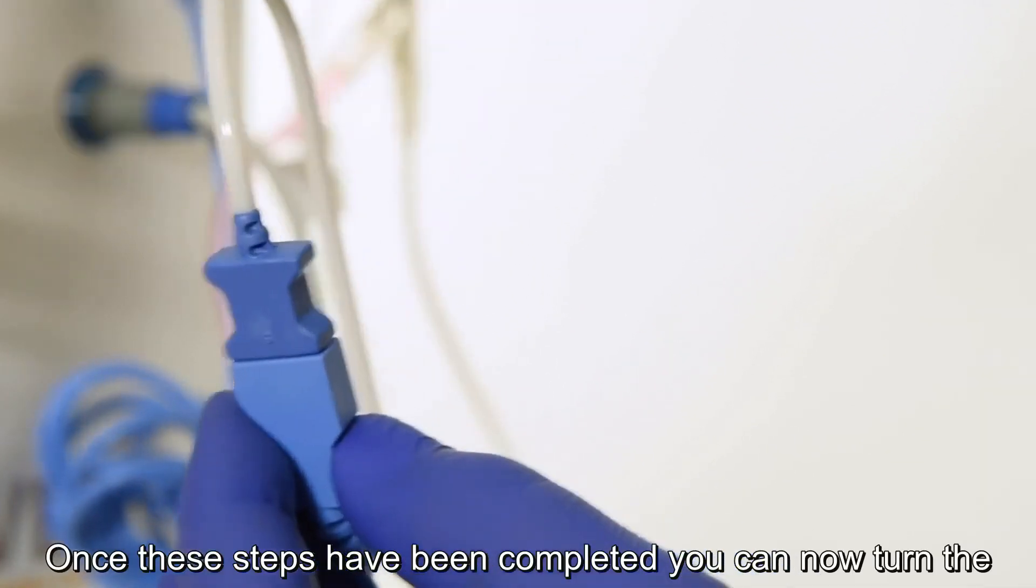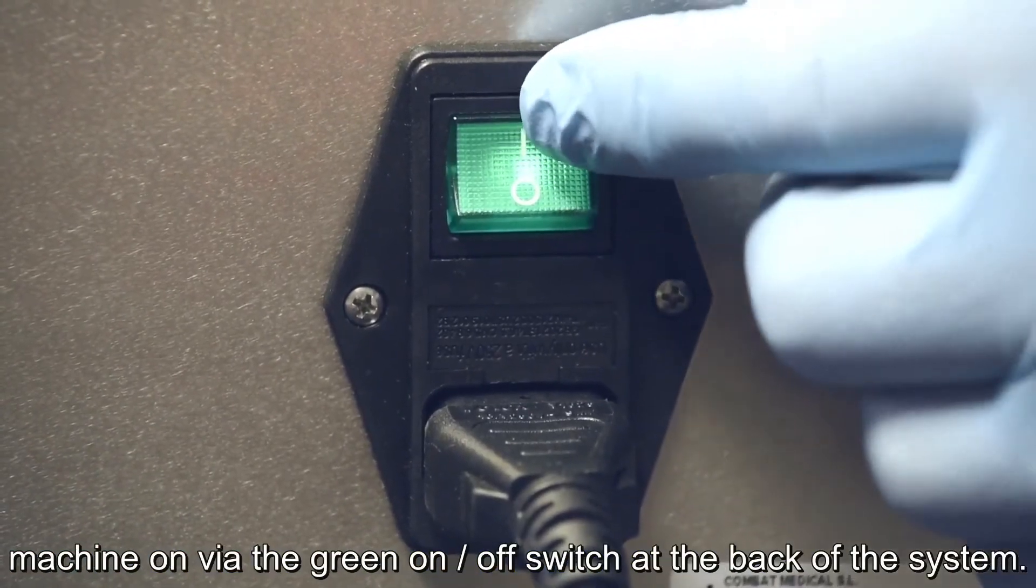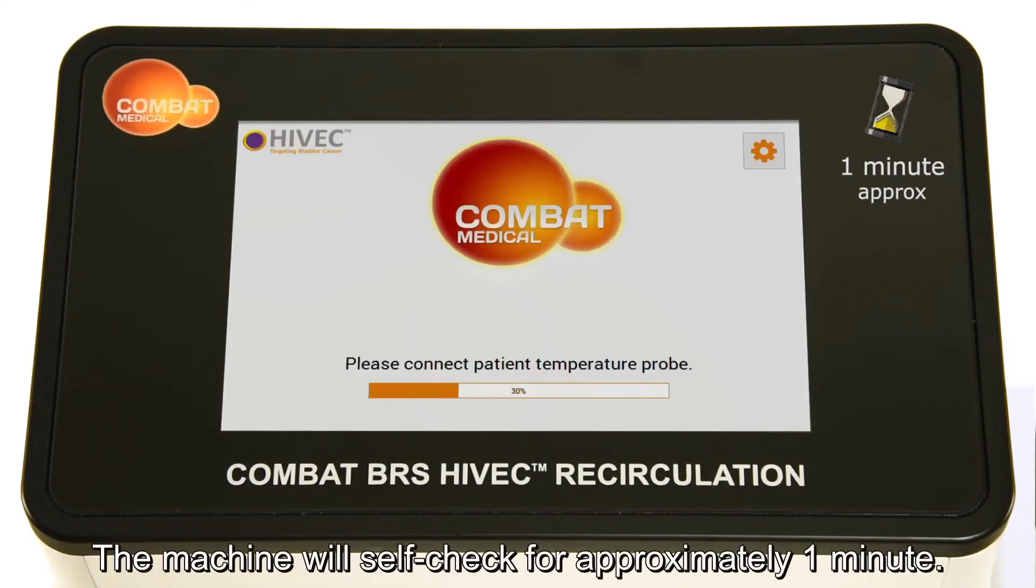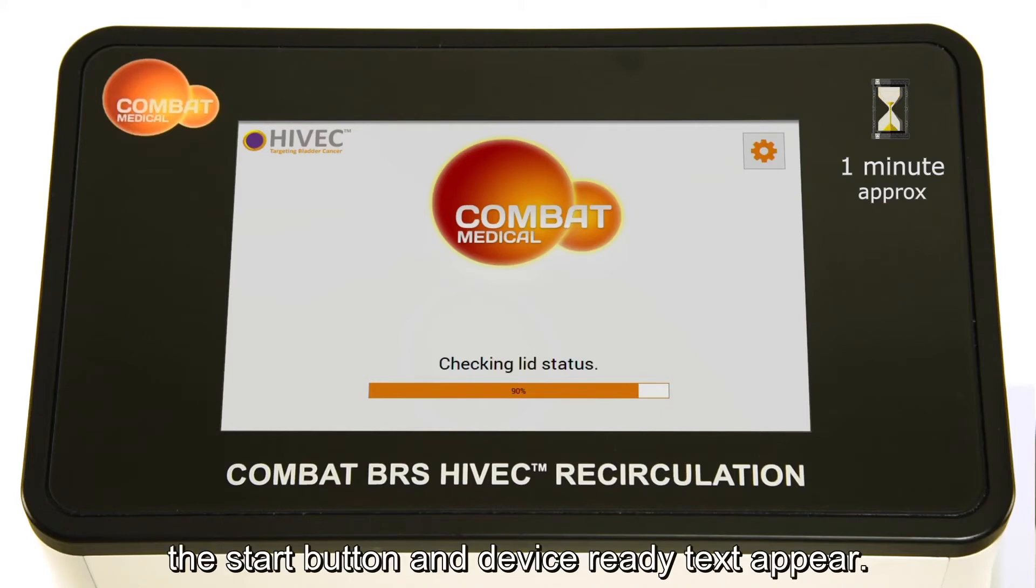Once these steps have been completed, you can now turn the machine on via the green on-off switch at the back of the system. The machine will self-check for approximately one minute. Only once this is successfully complete will the start button and device ready text appear.